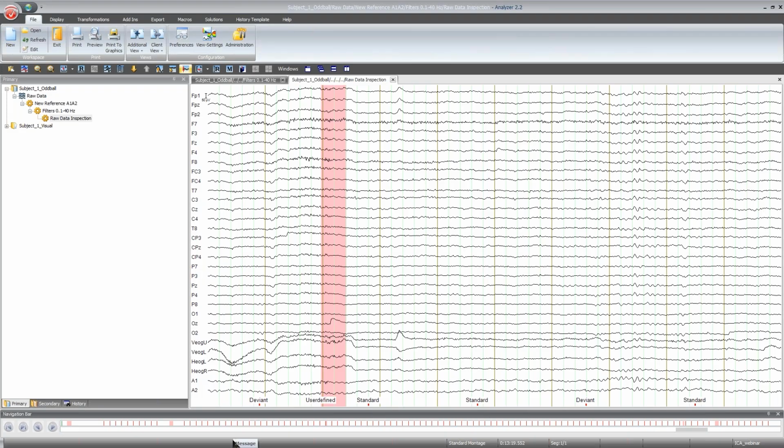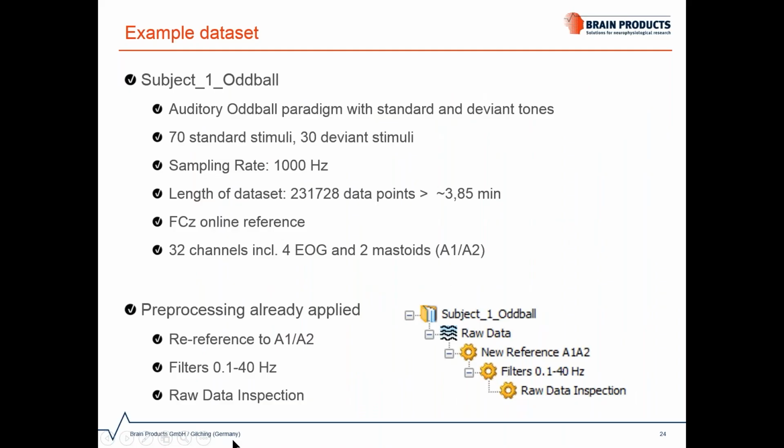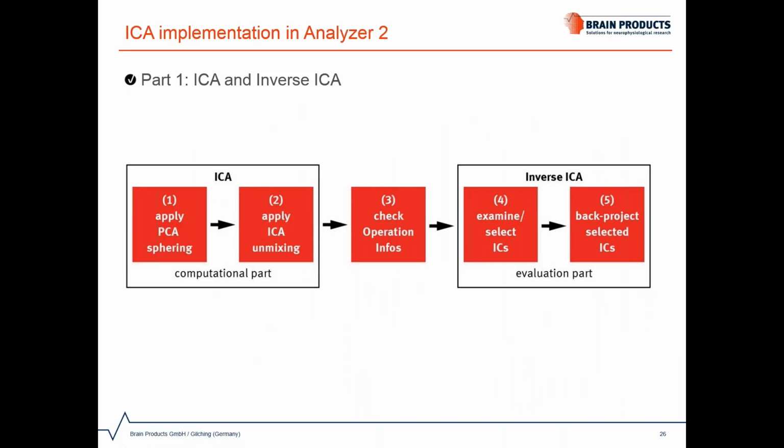Okay. So just before we work on this, let's very quickly go back to the slides for one more slide, because I have here already another sketch of the ICA process that we are going through now, and it's broken down into a couple more steps. We already saw before the three main parts in our sketch: the computation of the ICA, the quality check, and the evaluation.